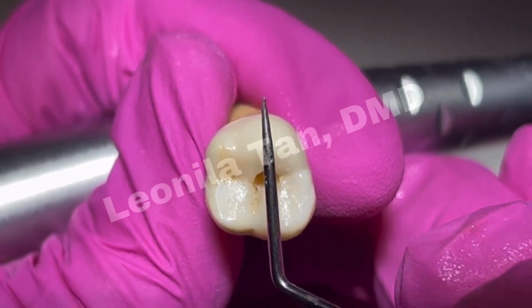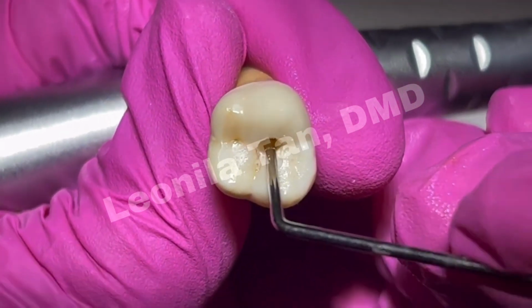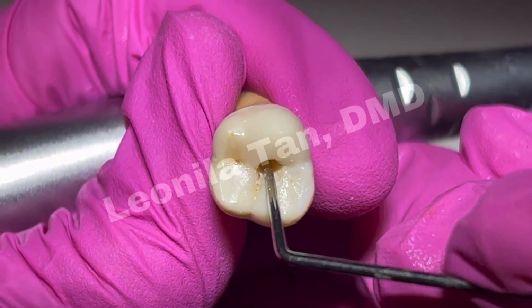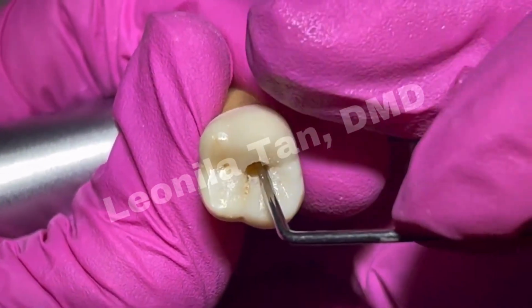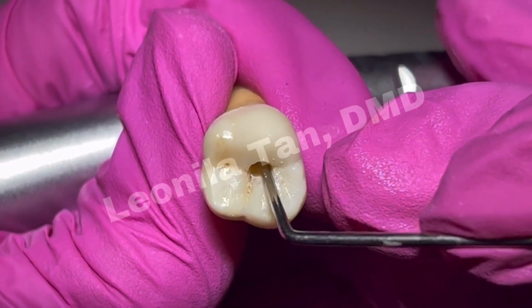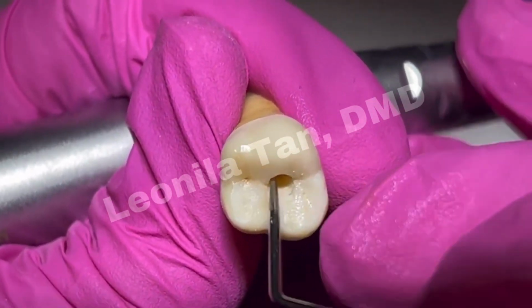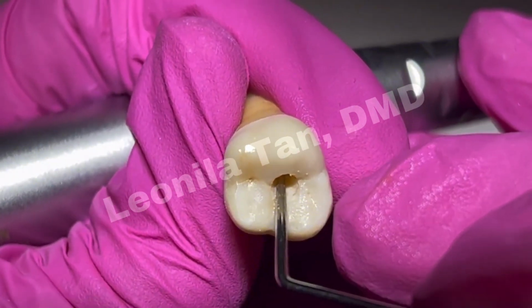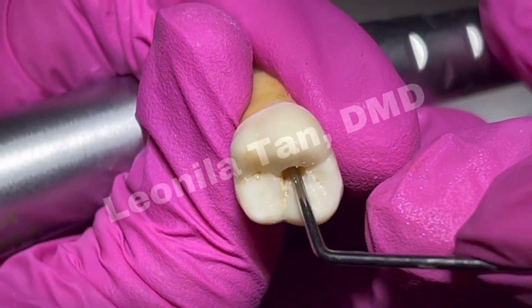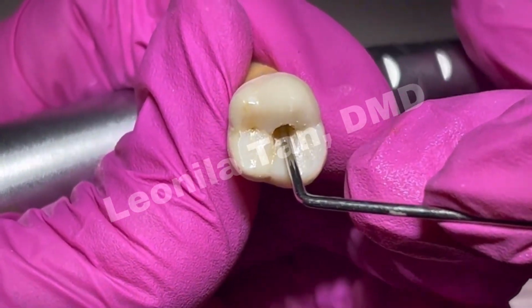So your initial entry is always the same, as I mentioned, but as you probe, like in this case, I feel that the entry is still near the palatal cusp, but it's now directed slightly distal. I entered initially there, but my drop seems to be going slightly to the middle.